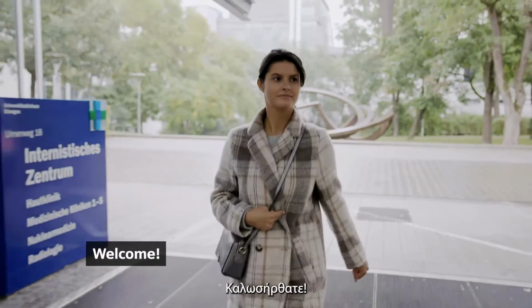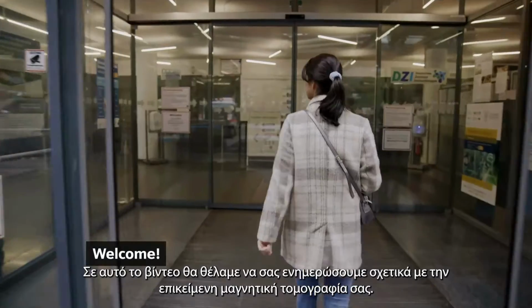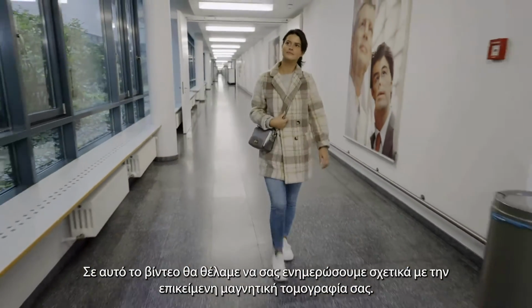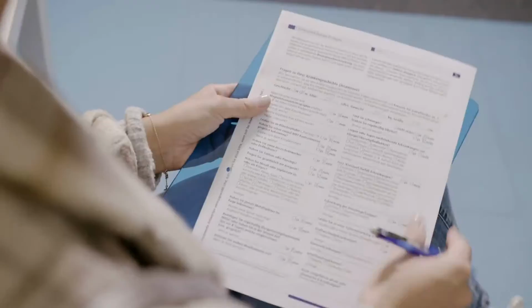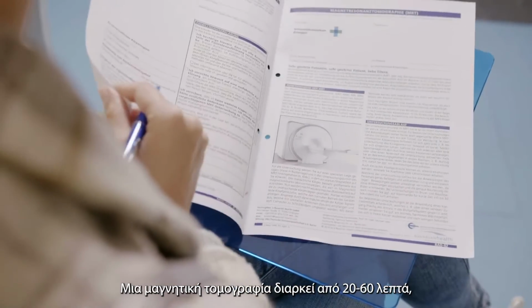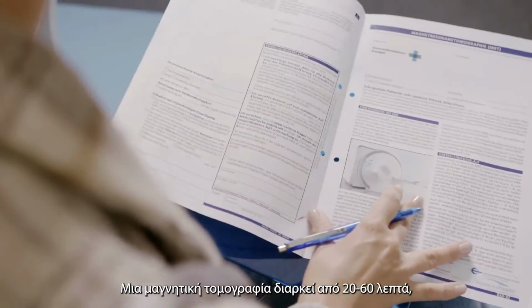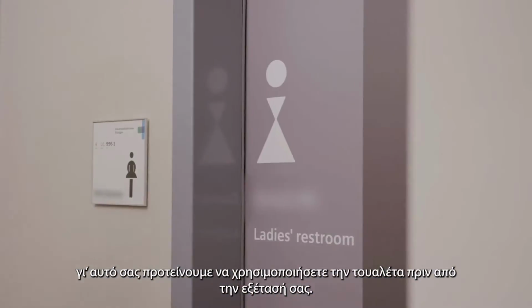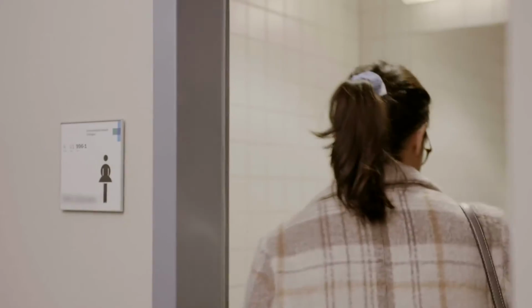Welcome! In this video, we'd like to tell you a little bit about your upcoming MRI examination. An MRI examination lasts between 20 and 60 minutes. Therefore, we advise you to use the restroom before the start of your exam.